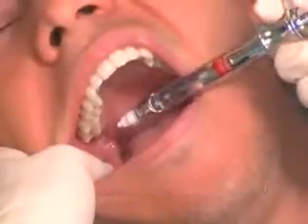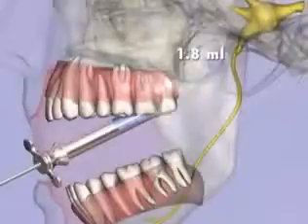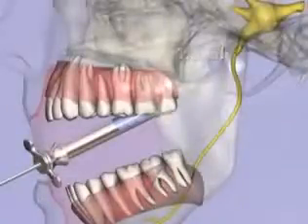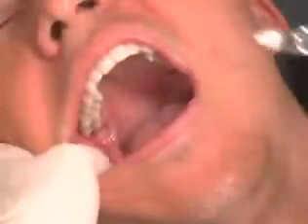After negative aspiration, 1.8 mL of anesthetic is slowly administered. Following withdrawal of the syringe, the patient is asked to keep their mouth open for 2 minutes.